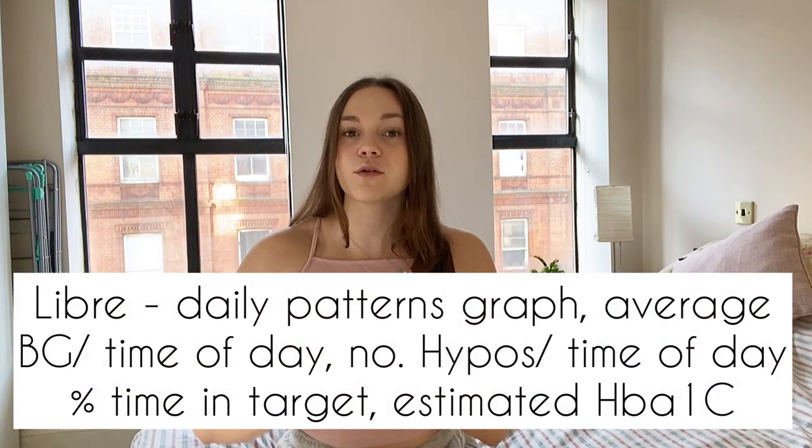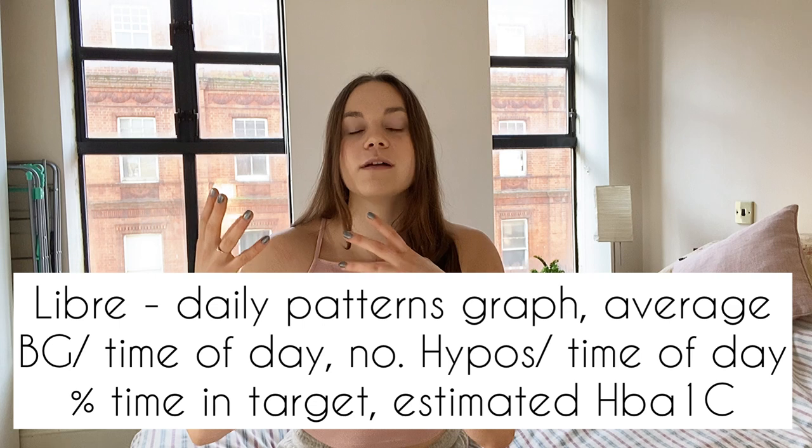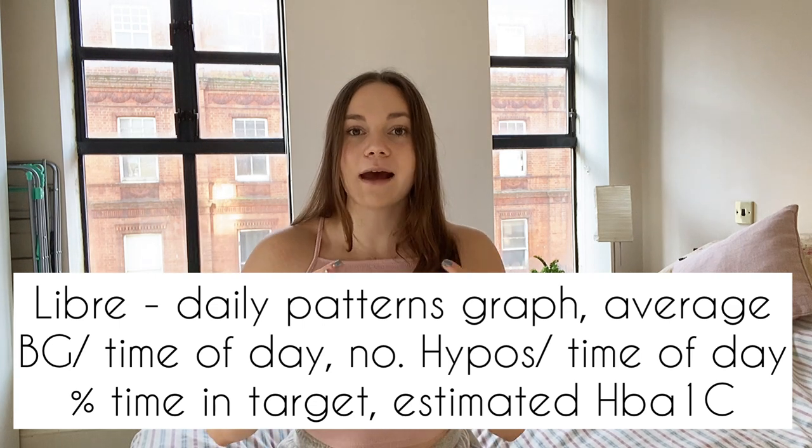The Libre shows a graph of your average daily patterns, your average glucose per time of day, the number of hypos per time of day, time spent within target range, and your estimated HbA1c — all shown for the last 7, 14, 30, and 90 days. The Libre app also lets you order new sensors directly, and you can set reminders to inject and scan, which is really helpful if you sometimes forget your basal or bolus insulin.